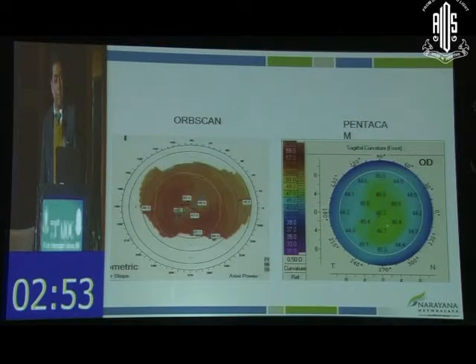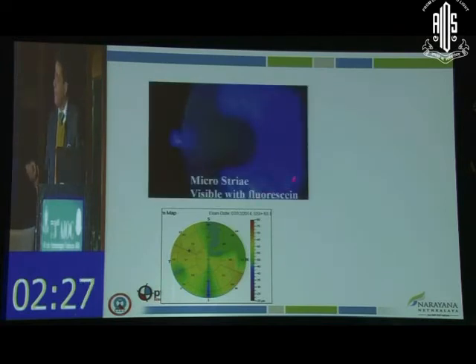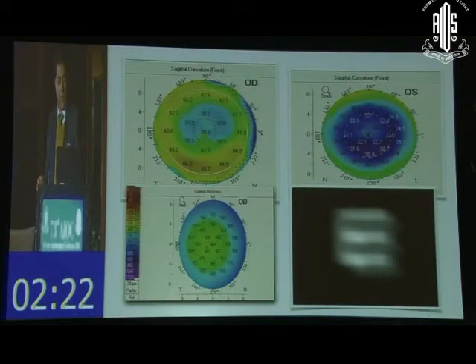And when I mentioned the Randleman criteria, this is what I was telling. If you look at this, there is a skewing, the thickness, a lot of tissue was burnt on this patient, and the most dreaded complication today of refractive surgery, when you're not very clear with your diagnostics, is ending up with a patient with post-LASIK ectasia. And post-LASIK ectasia is very dreaded, and many times if you don't treat this well, you may go for a transplantation. Flap stria is one thing which can change epithelium and also cause a lot of scatter.